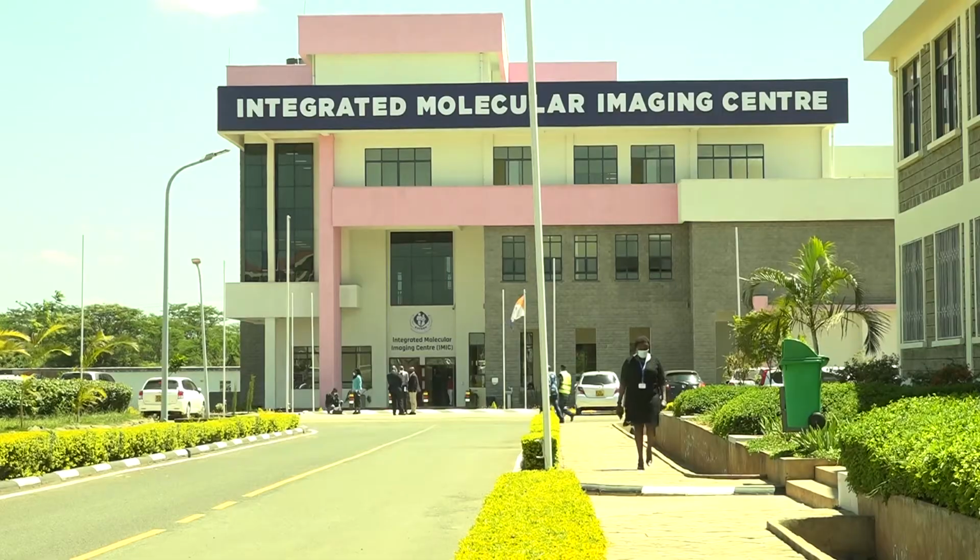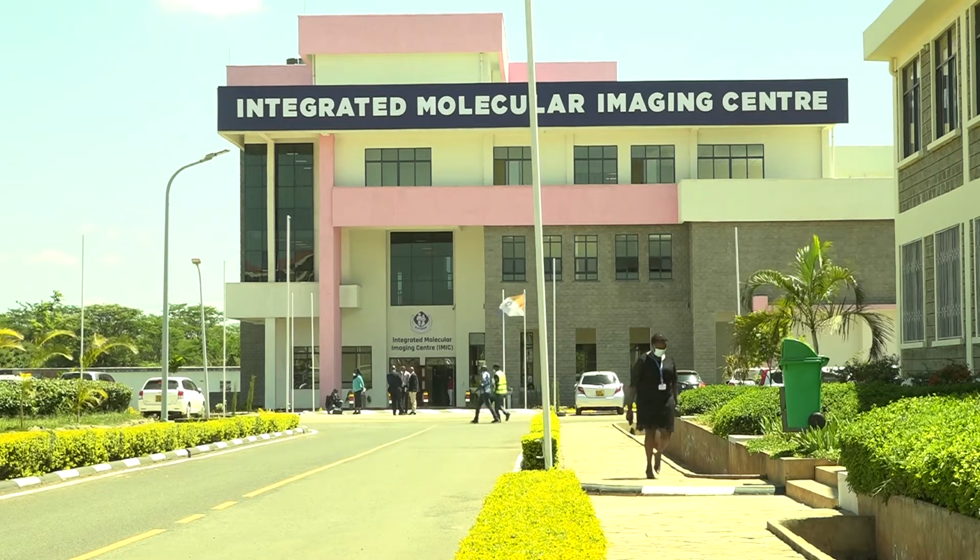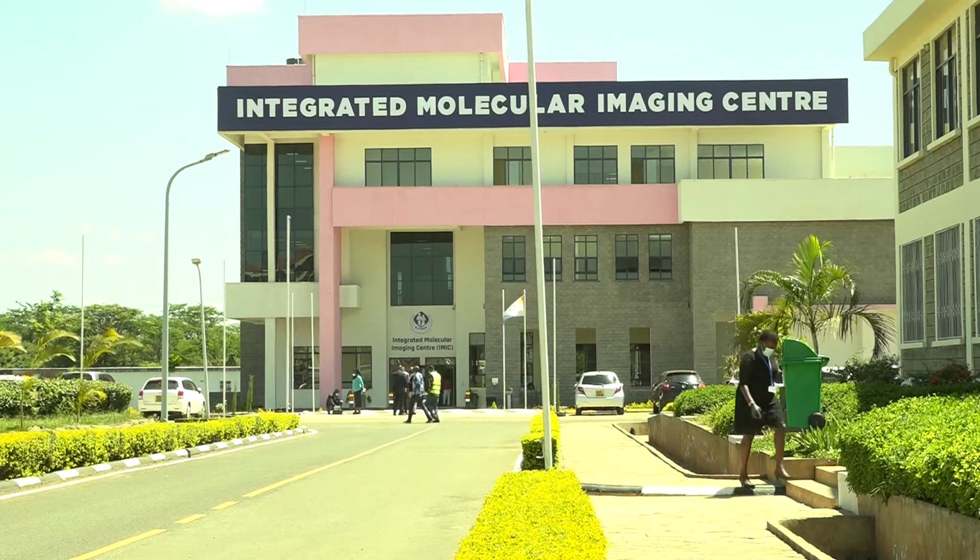To make sure that they're stable, and once we get a referral from the oncologist, we inject the patient with something called FDG, fluorodeoxyglucose, and this is the one which gets concentrated. It's a glucose analog basically. It gets concentrated in the cancerous cells in the body. So depending on the area of affection is what the doctors now decide where the treatment should be given.